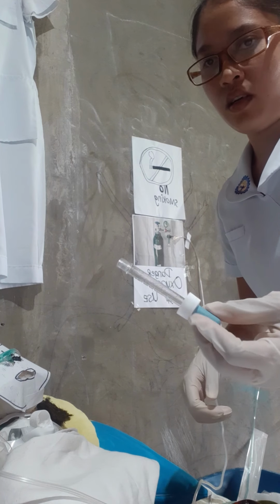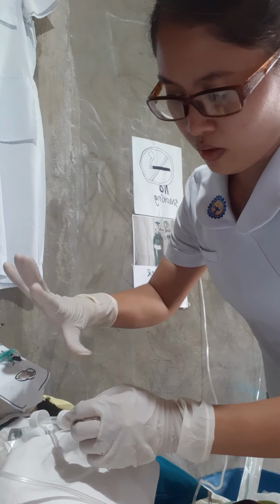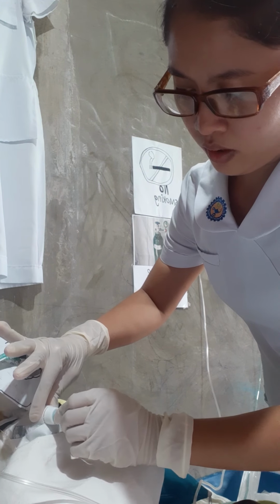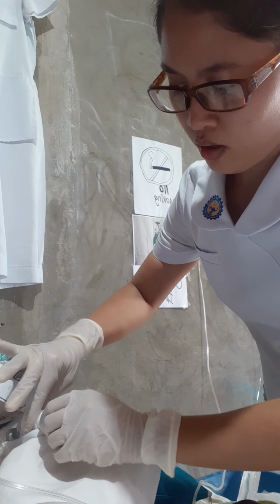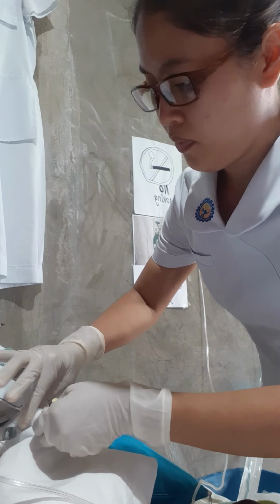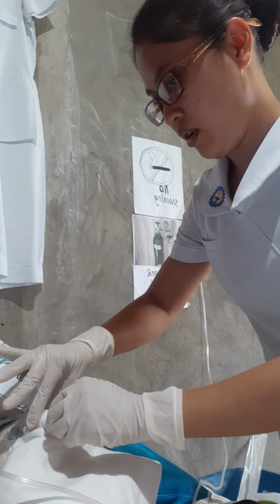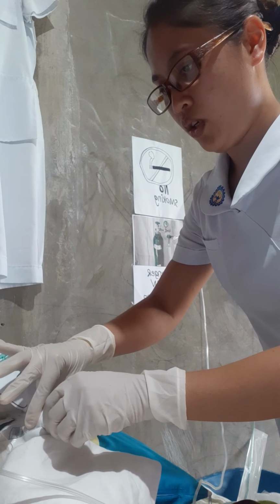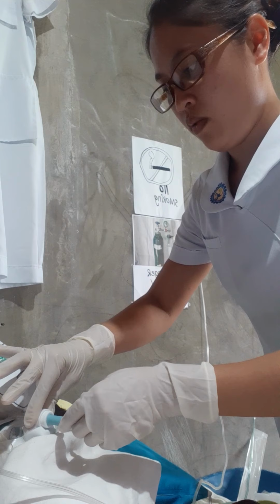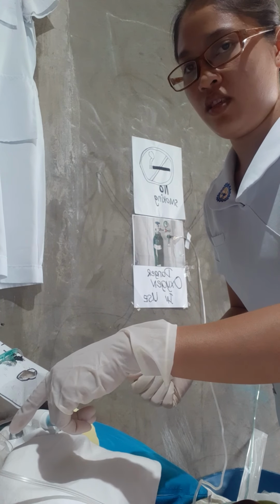Then after cleaning it, we need to return it and close. Then we should hold the faceplate and close. We need to rotate it clockwise. Then check if the inner cannula is secure, and if needed, we reapply the oxygen device.